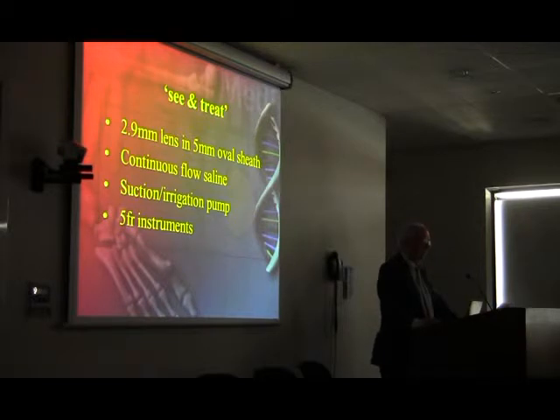Now, the saline versus gas thing, I think, has probably moved on to saline. And the gas, as Walter mentions, is probably the gas going through. But the main problem with the gas, really, is that it pushes in and it creates a big pressure inside the cavity so that you can't really get a clear view. With the saline, you can let down the pressure and you're looking more like a natural view of the endometrium. Plus, you'll wash out any blood or bits or whatever out of it. So all in all, I think nearly everybody has gone over to saline.